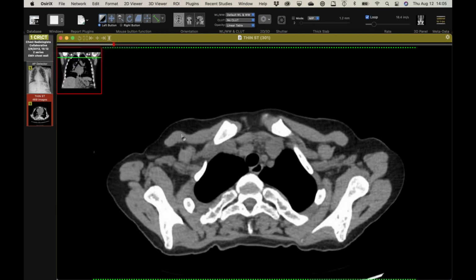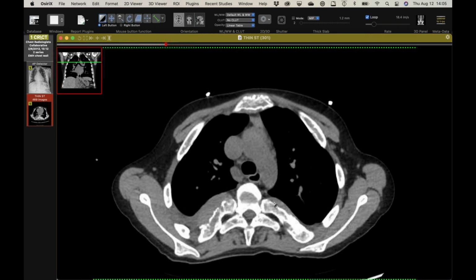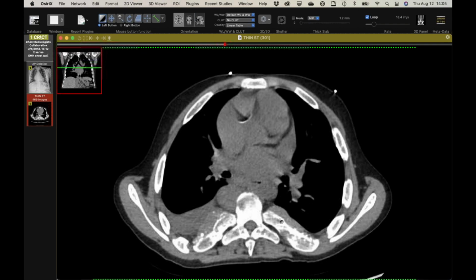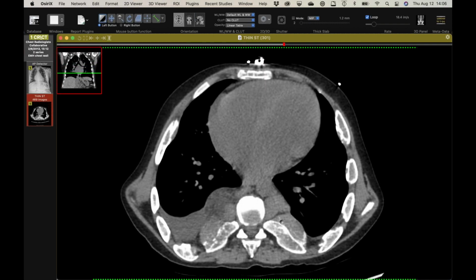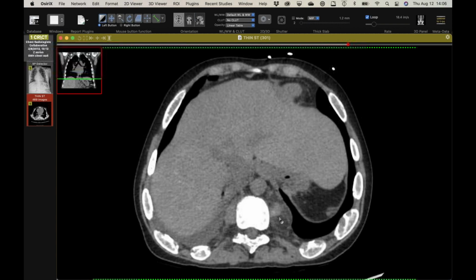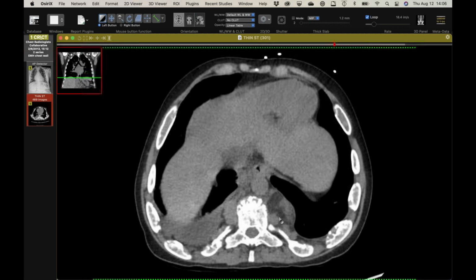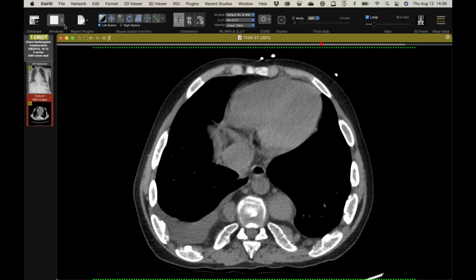And this is a CT scan, and you can see he's got all this soft tissue and this mottled appearance of his bones expanding out from it. And so this is a patient with thalassemia who has extramedullary hematopoiesis, but this is one of the more exuberant cases I've seen. We don't see a lot of thalassemia here in Wisconsin. We see some sickle cell, but we don't see a lot of this. So this was kind of just cool for me to see. I don't have a sulfur colloid or other scan, but I don't think we need it in this case.